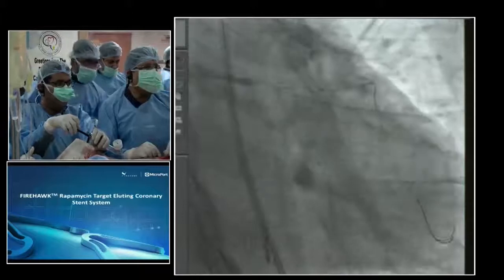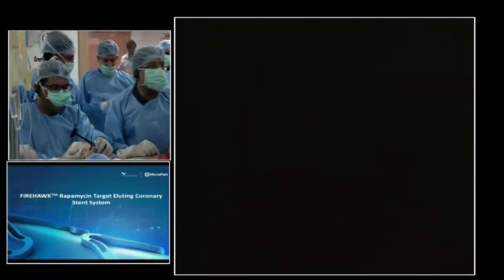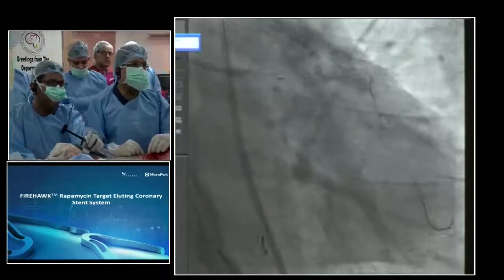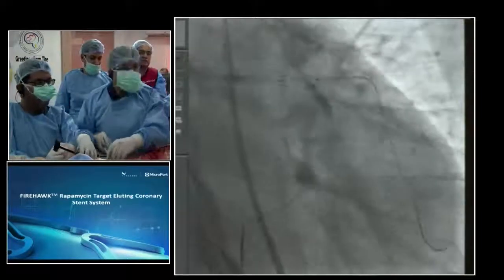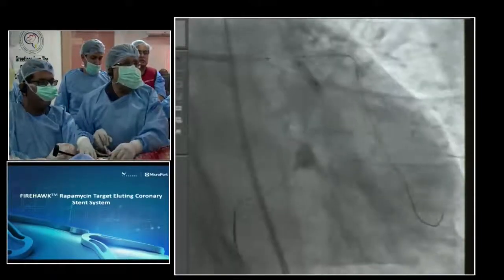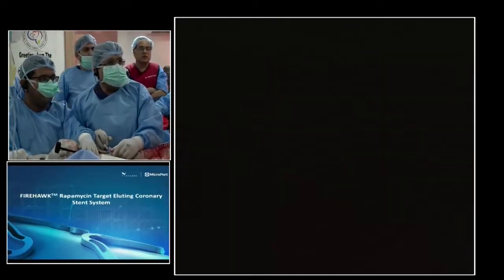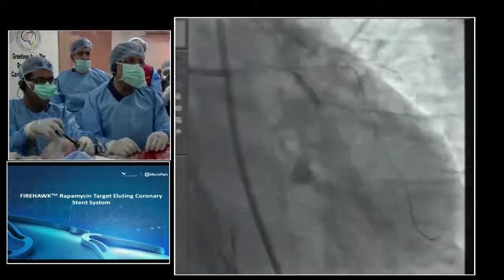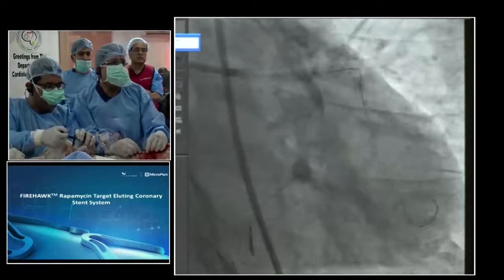Now what I do is, to have high pressures, it is always better to do something like snuggle. Snuggle. Go ahead with the circumflex. Otherwise the carina will be enlarged and wider. This snuggle is to be done at high pressures. Now what you do is just take a shot. That shot tells you that you are not too much into this. Go ahead. Now this circumflex is 20. Go ahead, LED also 20. So 20. So I am at 20.